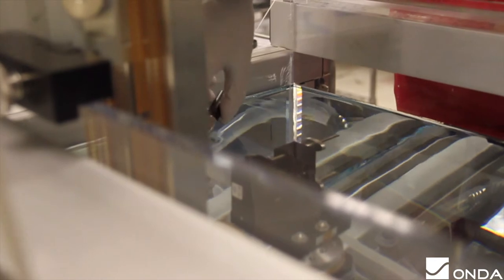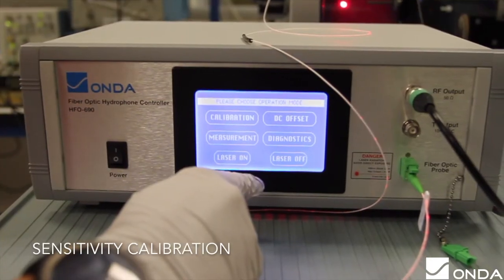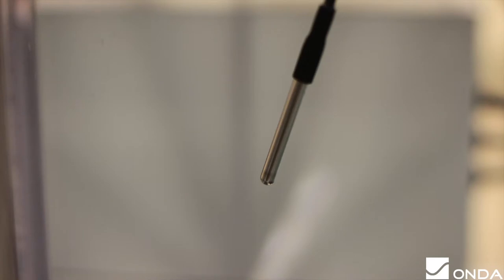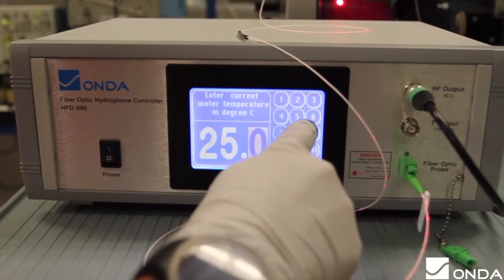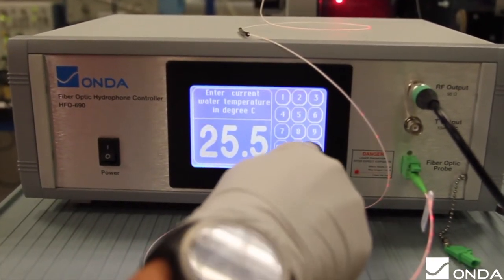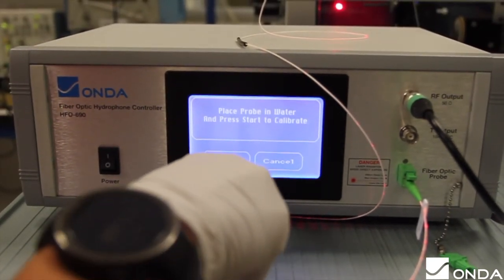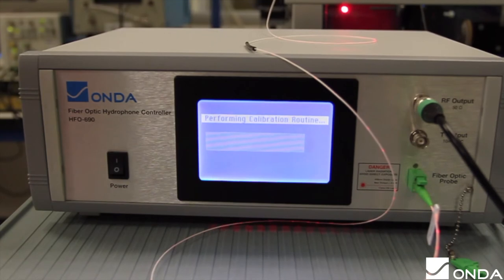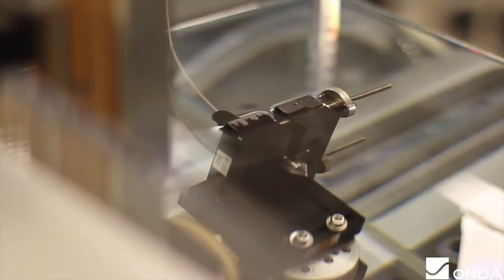A sensitivity calibration is always needed after a DC offset calibration. To start, press calibration in the main menu page. Make sure to measure the water temperature with a reference thermometer and enter the value in degrees Celsius when prompted. Press start after verifying that the fiber optic probe is properly connected and that the fiber optic tip is immersed in water. The HFO will then start the calibration. The normal value of the SSS should be greater than 5 millivolts per megapascal. If the SSS is lower than 5, turn off the laser, recleave the fiber tip, and try again.